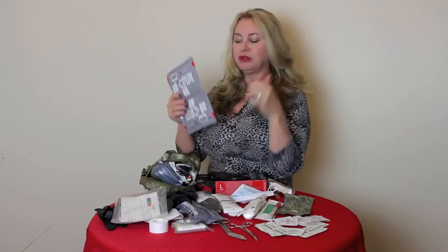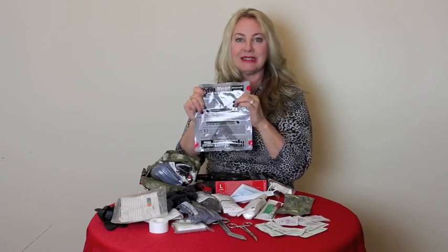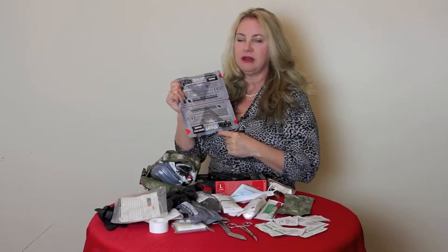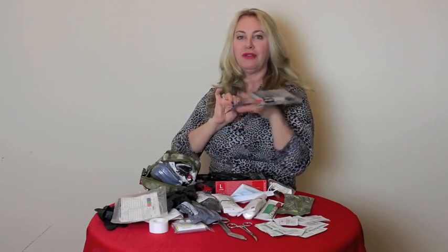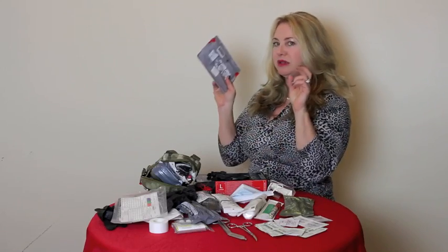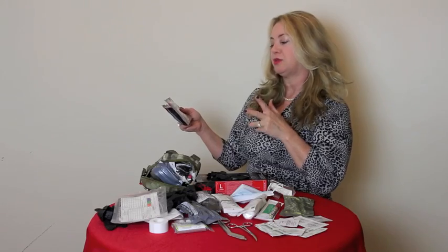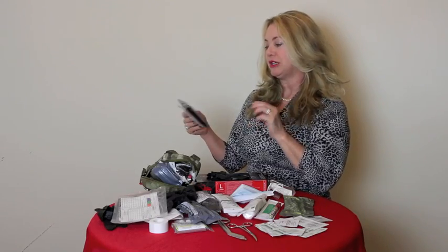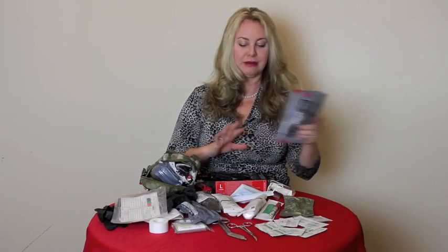If you've got an exit wound, use the second one. They're both the same exact chest seal. It's not one and one, okay? Works either way. And both of them have instructions. Fantastic. And these don't expire until June 2019. And they were just produced in June 2014. But they're in a sterile package, so you don't have to worry about it.